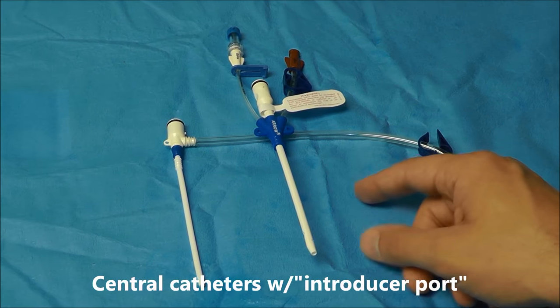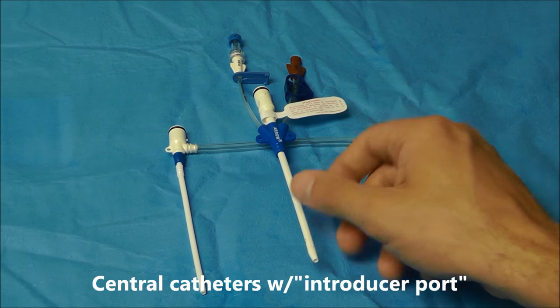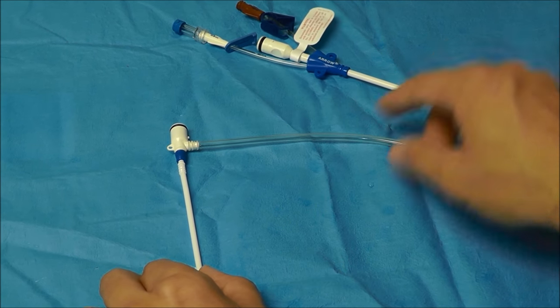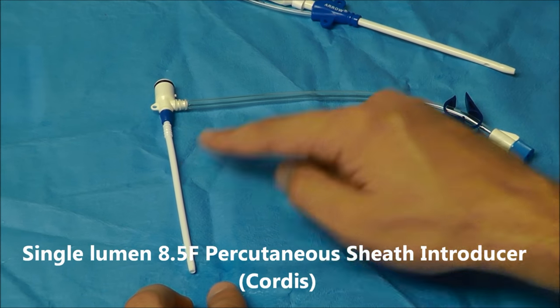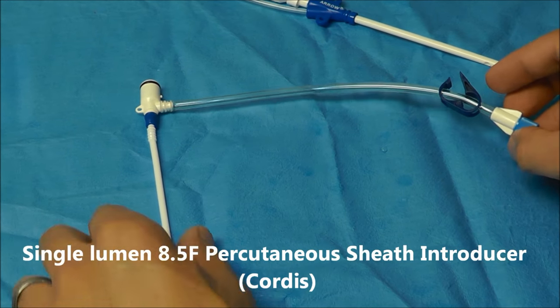Now I want to move on to the central line catheters that have an introducer port, and two examples of this are: number one, you have an 8.5 French cordis or percutaneous sheath introducer.